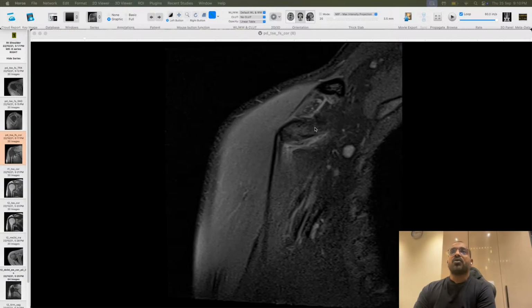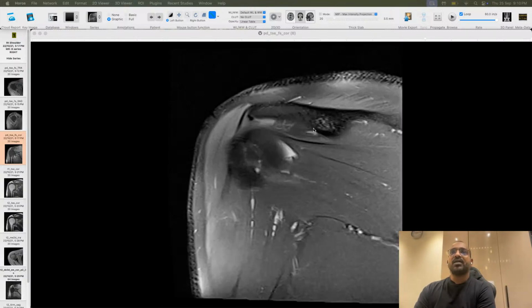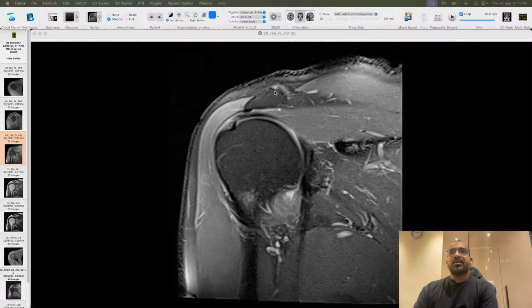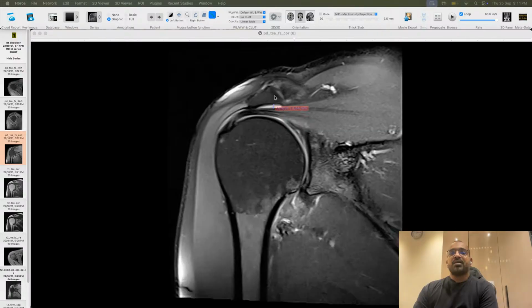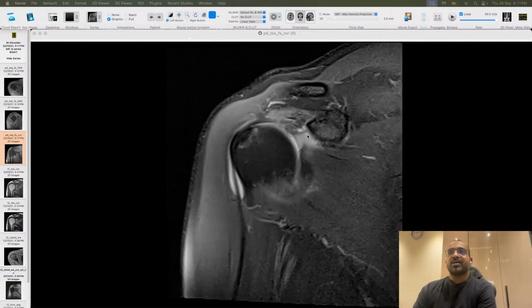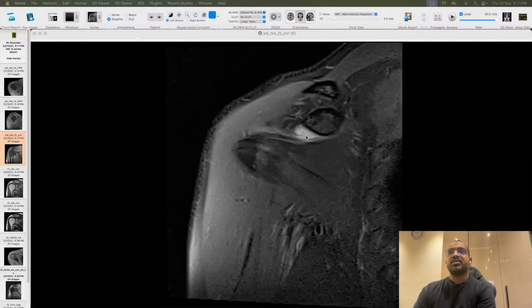So this is the tip of coracoid. Where is the coracoid located? It is anteriorly placed. If I palpate, I will palpate the coracoid process. So if you see, this is the acromion. I'm going anteriorly, and this is the coracoid. If you see this, there is minimal fluid beneath the coracoid. So there is a subcoracoid bursa also. In this subcoracoid bursa, there is minimal fluid.